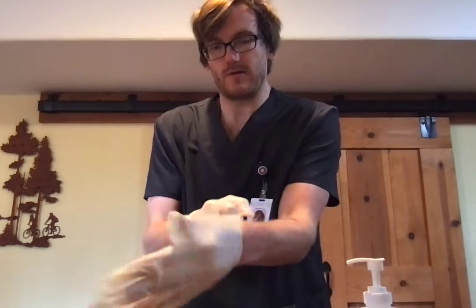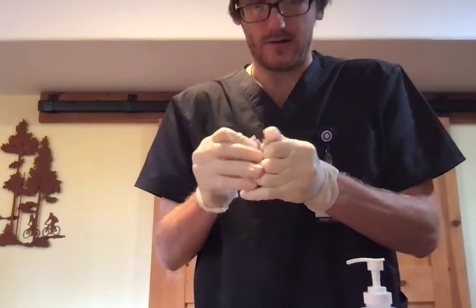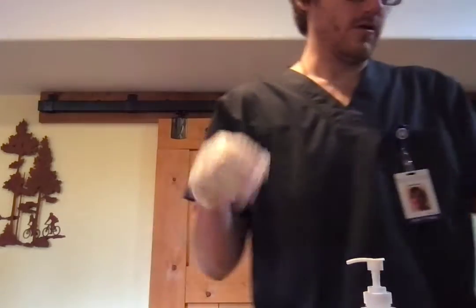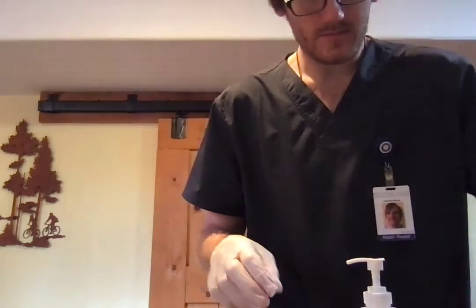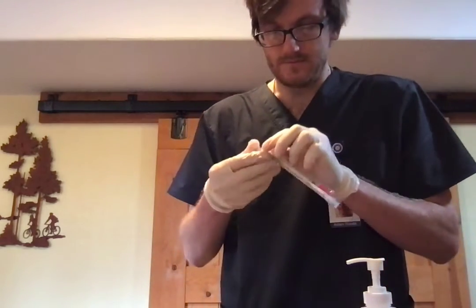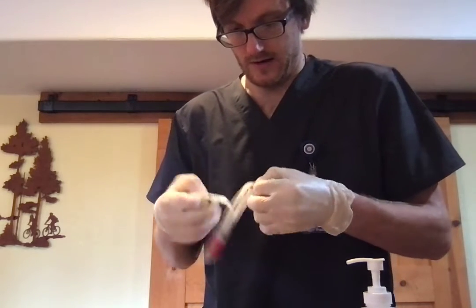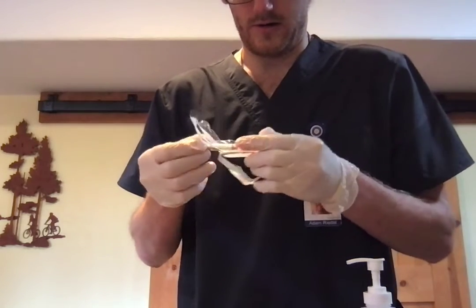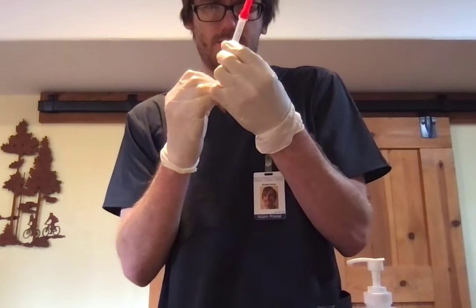Okay, and then what I want to do first is alcohol swab the top of the multi-dose vial, and I want to also check if it was potentially expired or not, because typically these multi-dose ones will have an expiration and opened date on the packaging. And then just verifying again my patient's identification and my order on the MAR, which is indeed 1,000 units.